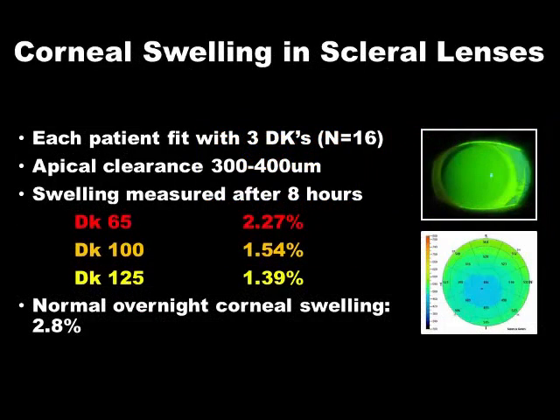Now, there's been a few studies that have looked at scleral lenses and the amount of oxygen permeability making it through them. And most of the studies that have come out at present are theoretical calculations of oxygen permeability through the plastic. And we know from years and years of vaulted scleral lens fitting with thicknesses of 0.3 millimeters or higher, our patients aren't showing signs of edema. They aren't showing signs of the cornea or tissue being starved of oxygen.